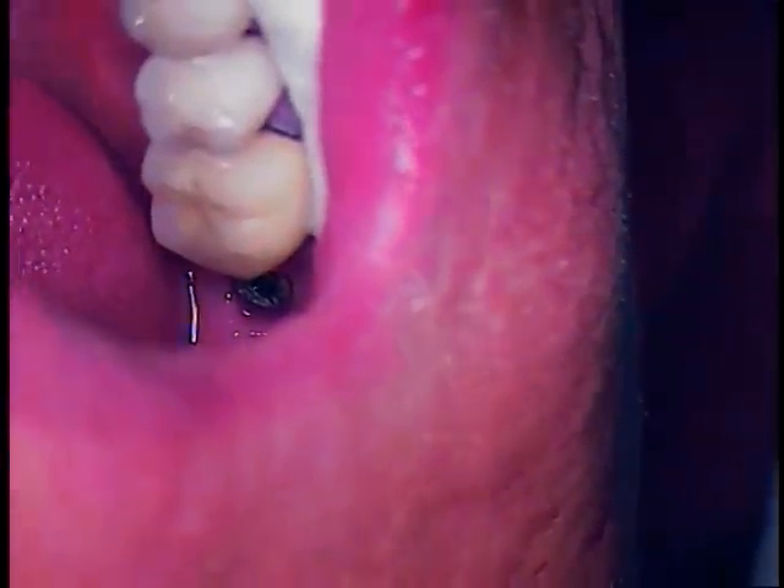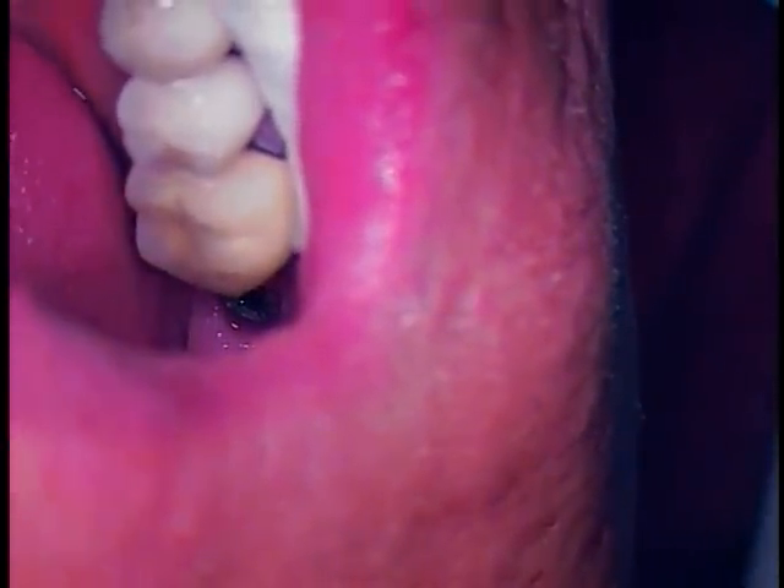This is Dr. Jerry Cuomo. Welcome back. We're now going to go ahead and make our attempt to rescue the Straumann TLK solid abutment.